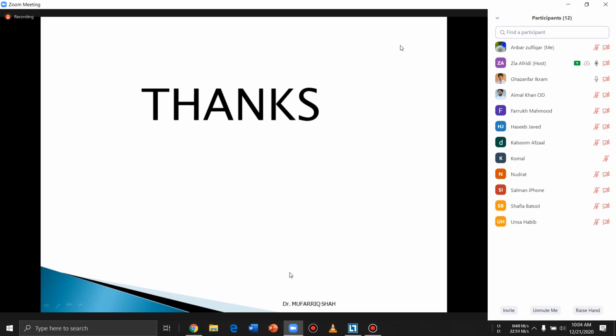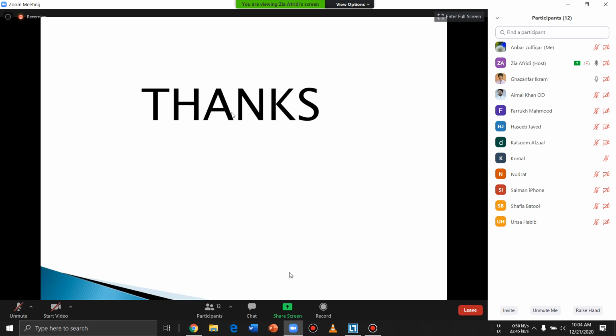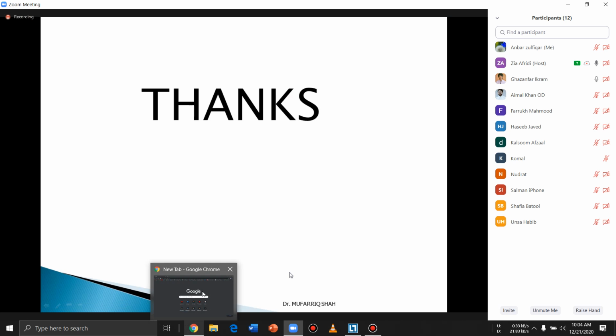تو PCO اگر آپ دیکھ رہے ہیں تو کچھ ایریا پہ بہت تھک ہوگی، کچھ ایریا پہ تھن ہو جاتی ہے. تو یہ جو PCO بن جاتا ہے تو اکثر سینٹرل کلیئر ہوتا ہے. جب آپ افتالمولوجسٹ کے پاس بھیجتے ہیں کہ YAG لیزر کے لیے، تو وہ کہیں کہ بھئی سینٹرل تو کلیئر ہے، اتنی زیادہ تھکنیس نہیں ہے سینٹر میں کہ میں YAG لیزر کروں. جبکہ یہاں پہ جب آپ دیکھ رہے ہیں تو آپ سمجھیں گے کہ جو سینٹر، جسٹ نیئر ٹو سینٹر اور انفیریئر سائڈ ہے تو وہاں تھکنیس زیادہ ہے ایز کمپیئر ٹو سپیریئر سائڈ.